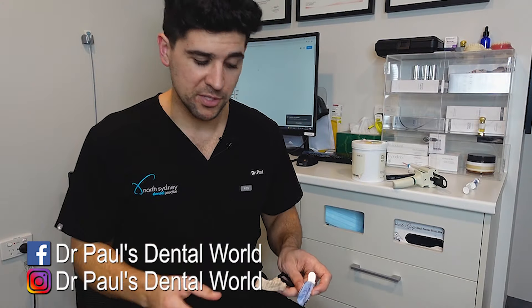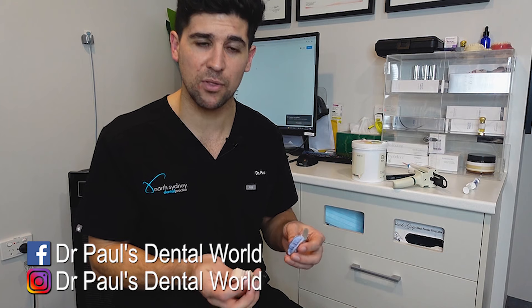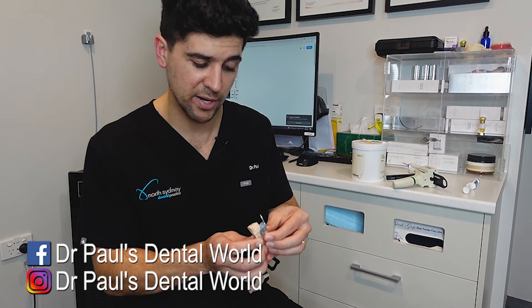Okay, so now you're at the point of the procedure where you've finished your crown preparation, you've taken your impression, and you're about to make your temporary crown. Now, before I just fill this up and plonk it over the top, I want to check to make sure that I know exactly where it fits — so when I do it, it's straight away. So I'll practice it a few times just to basically line up and get a visual on where that spot needs to be.